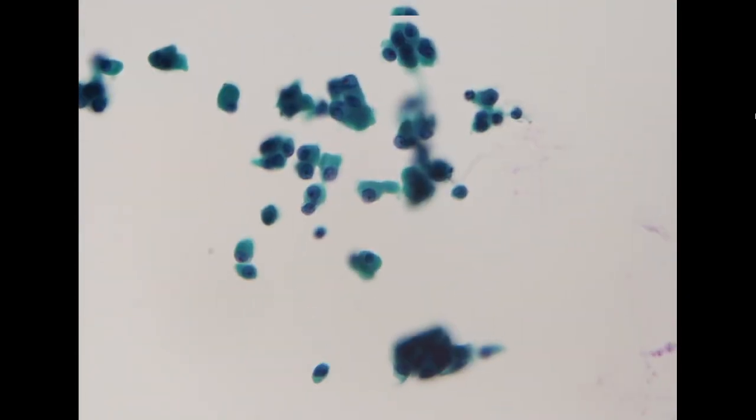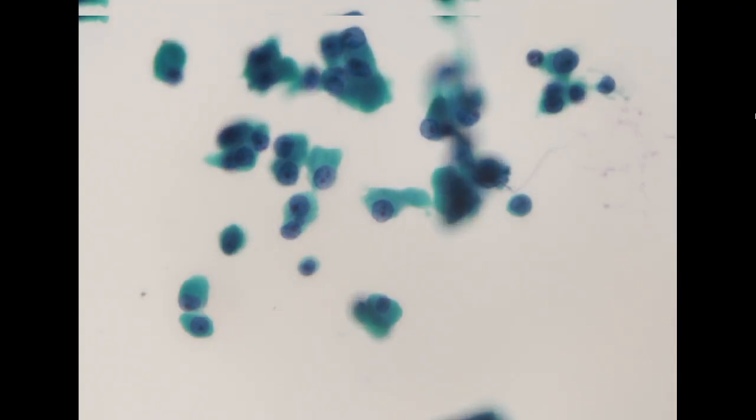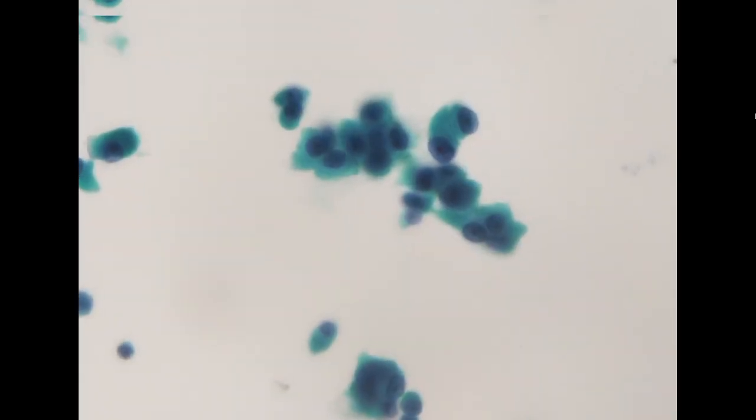So based on the cytomorphology, although it looks very much like a medullary thyroid carcinoma, because of the nuclear pattern, no neuroendocrine type of chromatin pattern, and we see distinct nucleoli, we still favor this is an oncocytic tumor just based on the morphology alone. So we performed two immunocytochemistry stains. The first one is calcitonin.